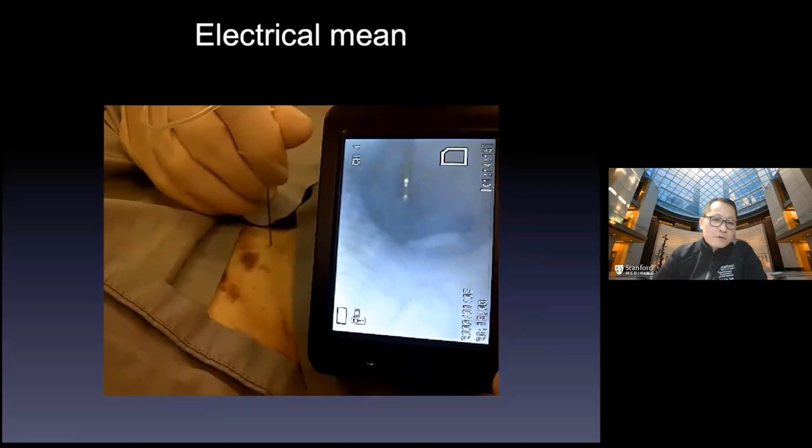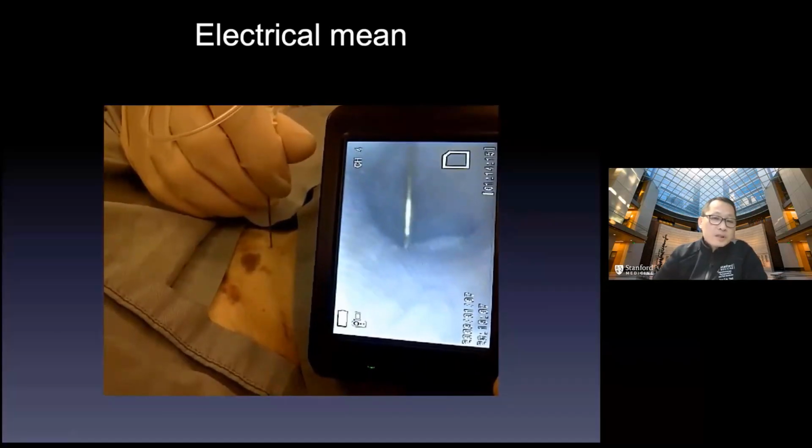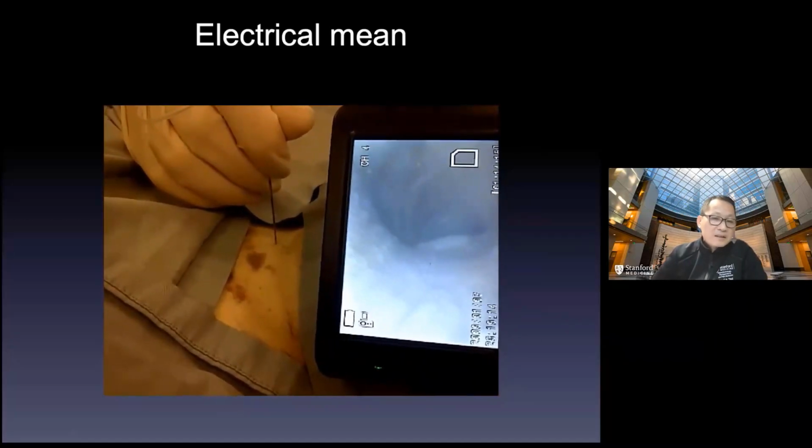When you see it pop through into the air, it's changing tone. Actually, if you look at a nerve stimulator, most nerve stimulators will change from green to red. You see, touching the back, it will change, to tell you that your needle is too far in.